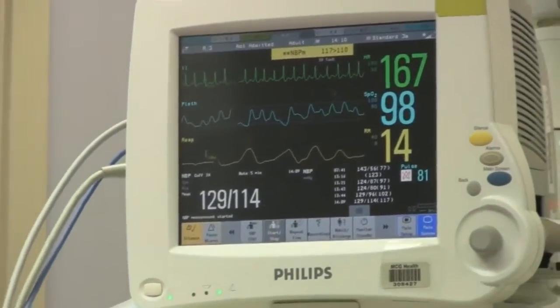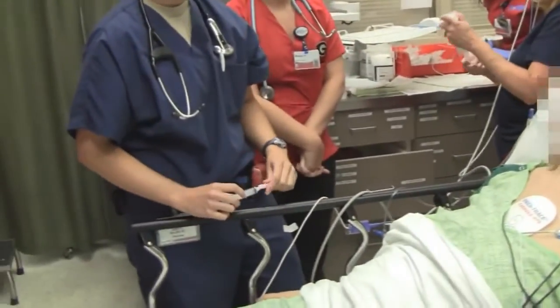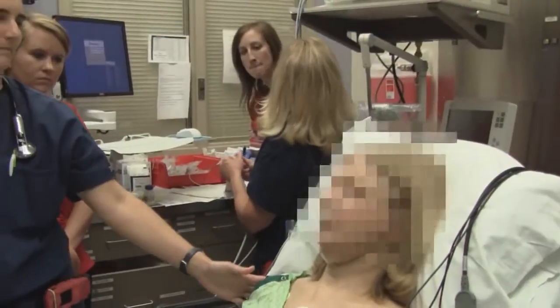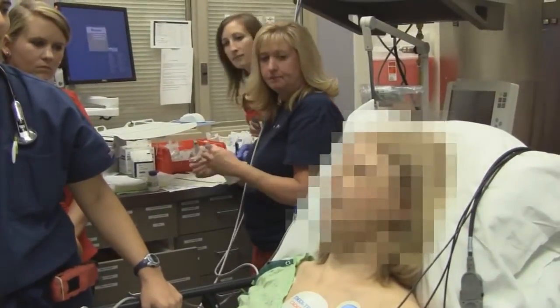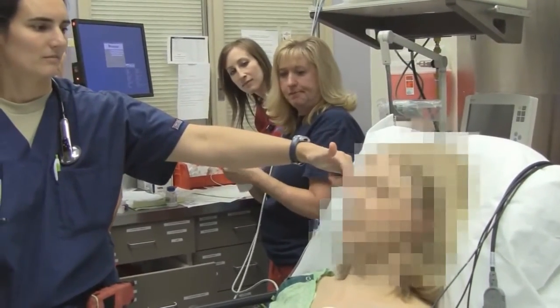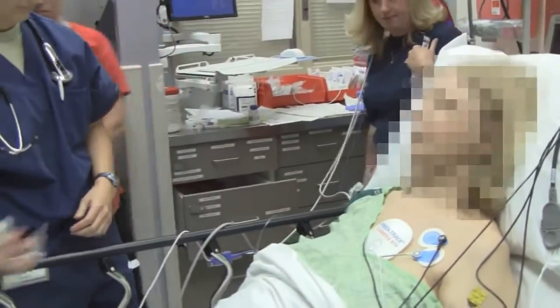How are you feeling? Getting sleepy? No — I think she's ready. Okay, everybody ready? Everybody clear.